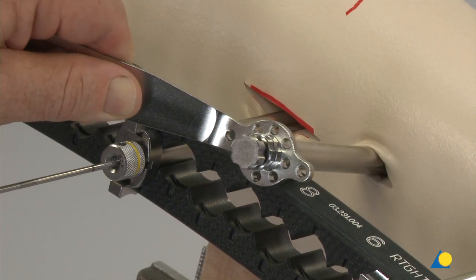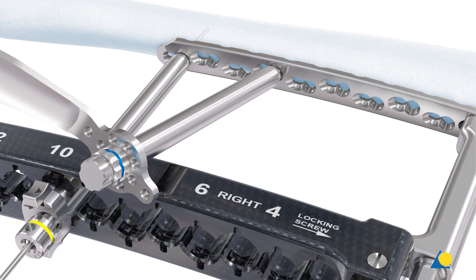The spherical tip of the variable angle drill guide should be gently pressed into the variable angle hole to ensure the lip of the drill guide stops on the edge of the hole to prevent drilling beyond 15 degrees. Depending on the desired angle, the assembly can be placed through the aiming arm hole or it can be placed outside of the aiming arm.